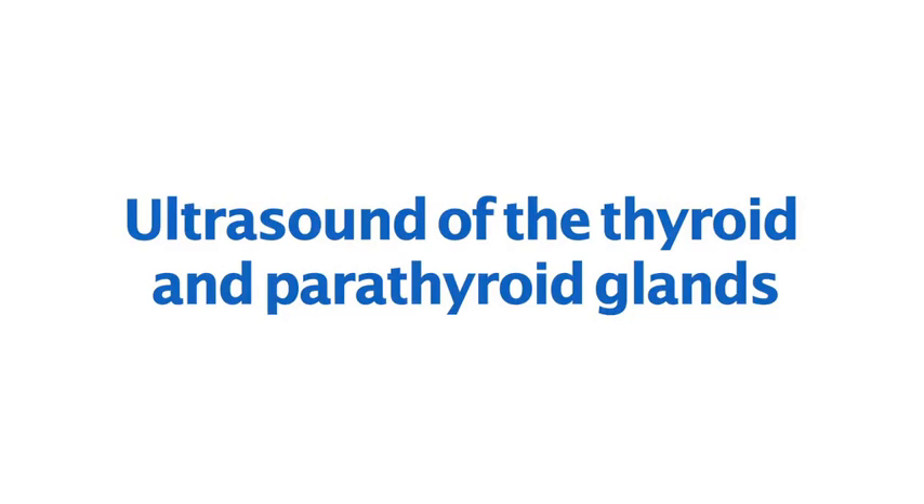This video demonstrates how to set up and perform an ultrasound scan of the thyroid and parathyroid glands.